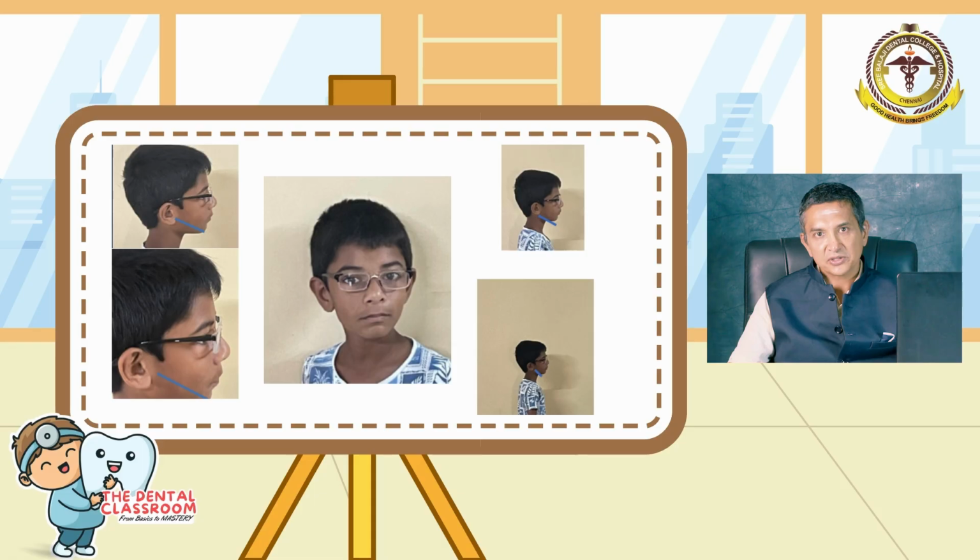This is an inherent problem with a photograph because there is no standardization. So when a medical professional takes a lateral view of the skull, you will have this problem because of lack of standardization, and the source of the X-ray can be kept at different points, leading to magnification of the lateral view of the skull.